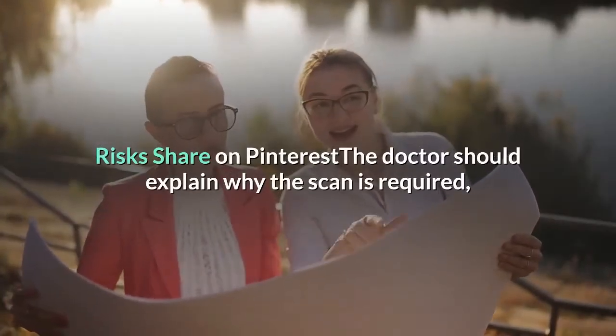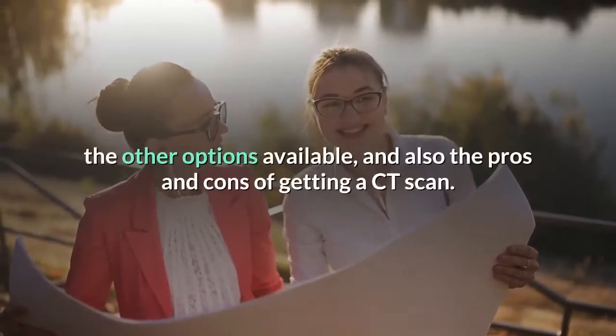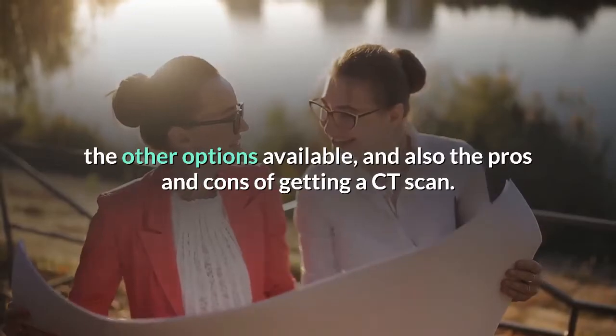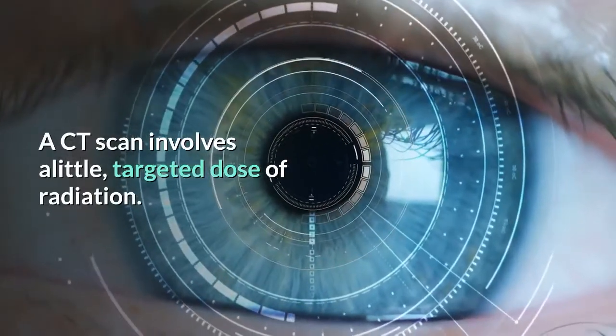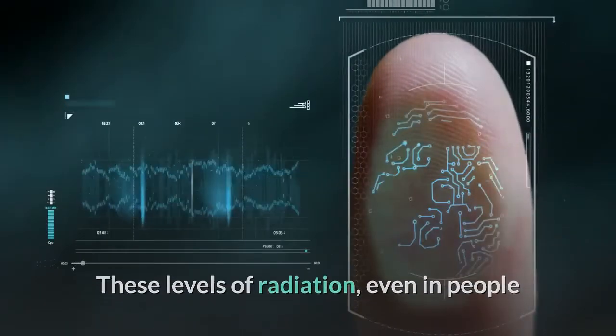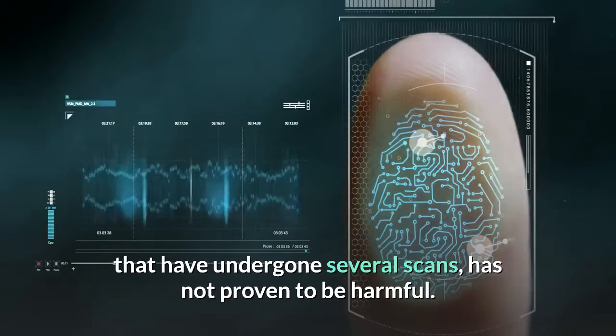Risks. The doctor should explain why the scan is required, the other options available, and also the pros and cons of having a CT scan. A CT scan involves a small, targeted dose of radiation. These levels of radiation, even in people who have undergone several scans, have not been proven to be harmful.